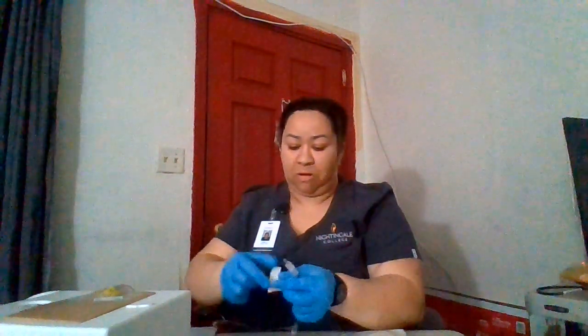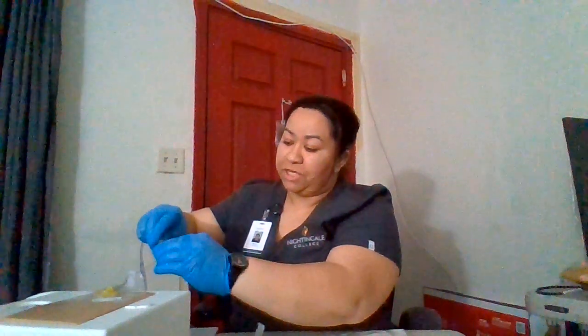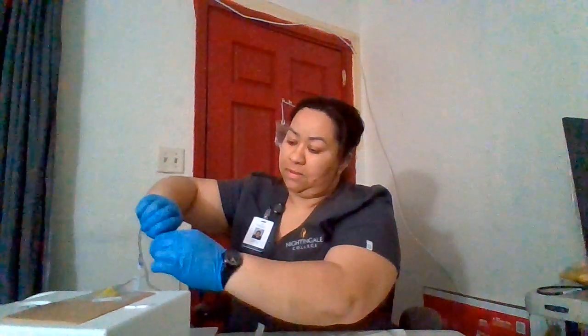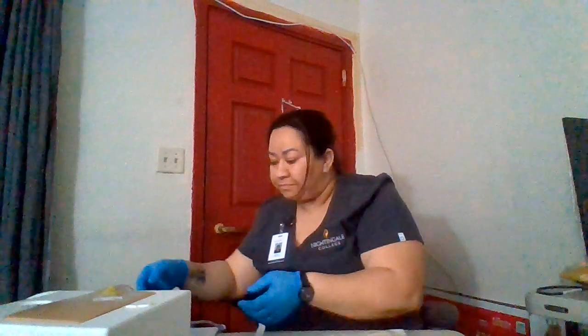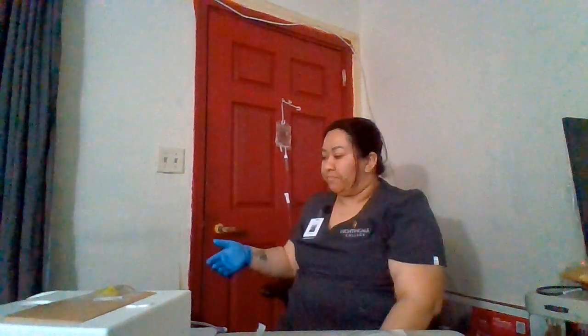I will be connecting this to the patient's IV site. So I have my IV site here. I'm going to be using one of these alcohol prep pads. And I will be cleaning. And then I will let it air dry. Okay, I will be attaching. Okay, it's connected.